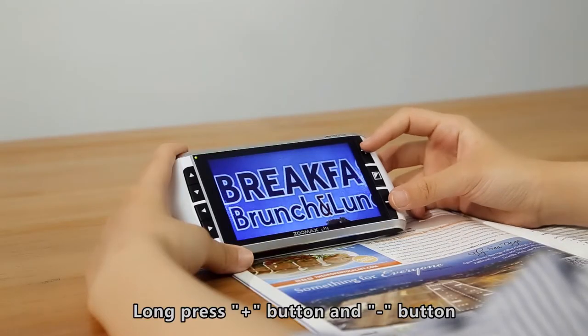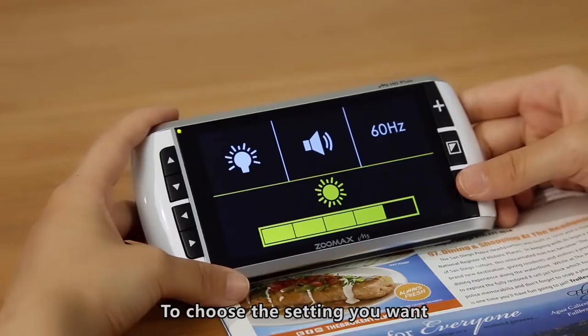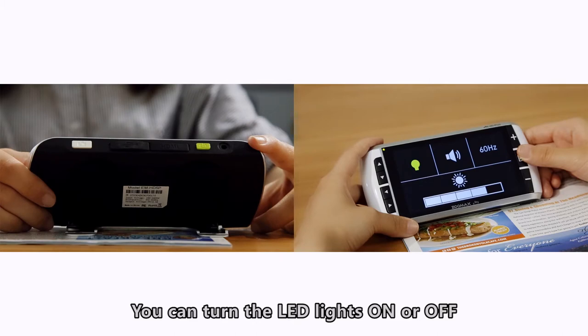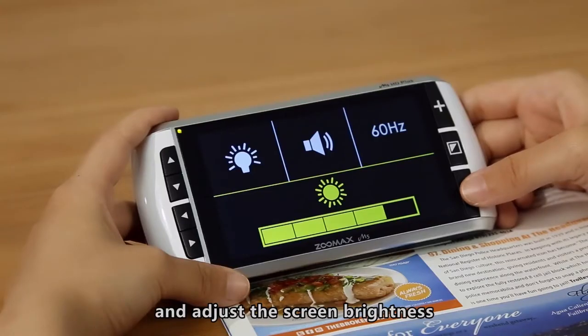Long-press the Zoom In and Zoom Out buttons at the same time for 3 seconds to enter menu mode. To choose the setting you want, press the Zoom In or Zoom Out button to cycle through the four icons. You can turn the LED lights on or off, the sound on or off, switch the frame rate setting between 50 Hz and 60 Hz, and adjust the screen brightness.